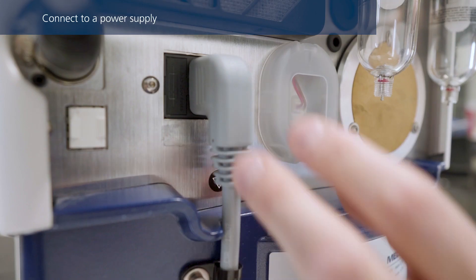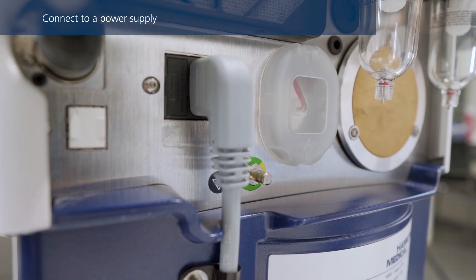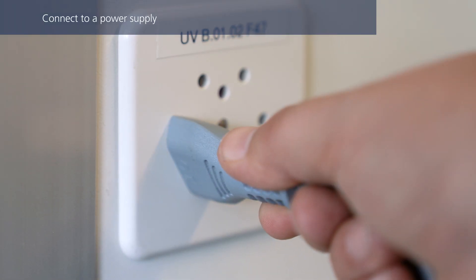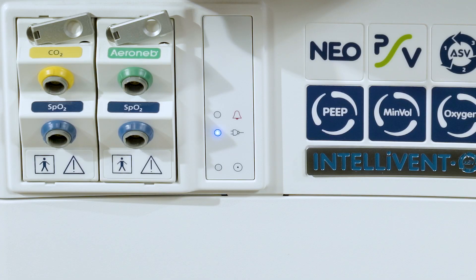Make sure the power cable is firmly connected in the socket to prevent accidental disconnection, and then connect it to the primary power outlet. The primary power indicator is solid blue when the ventilator is plugged in and connected to primary power, even when the ventilator is turned off. If the battery is not charging for whatever reason, the indicator will remain dark.